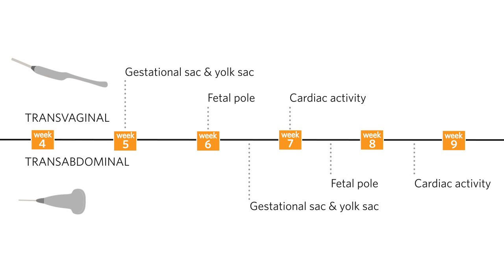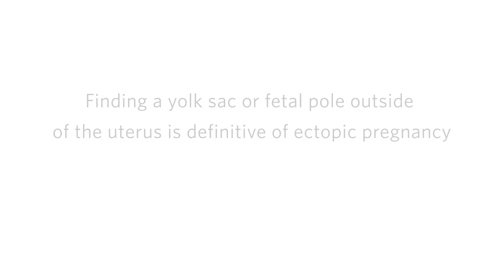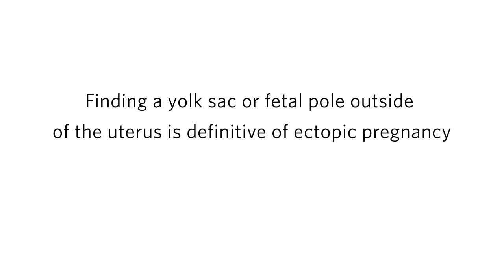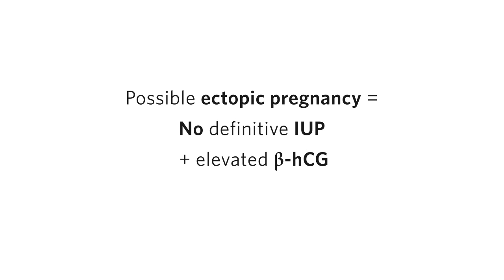In rare cases, you may be able to image a gestational sac containing a yolk sac or fetal pole outside of the uterus — this is definitive of ectopic pregnancy. However, more commonly, you will diagnose ectopic by finding no definitive IUP in the setting of an elevated beta-hCG.